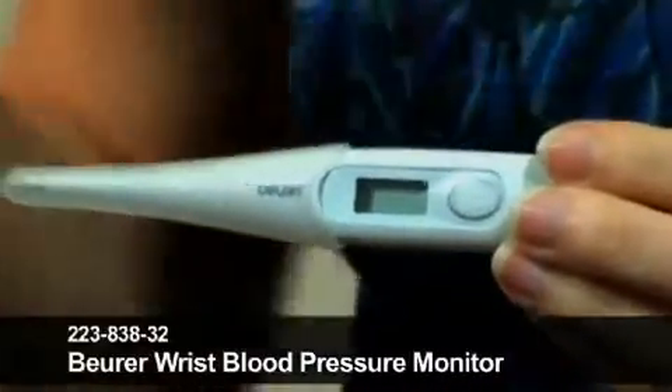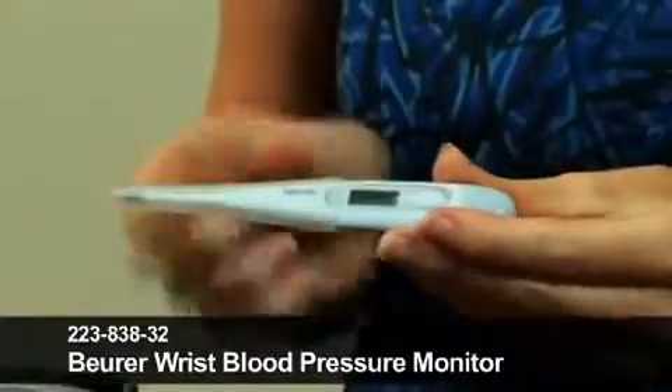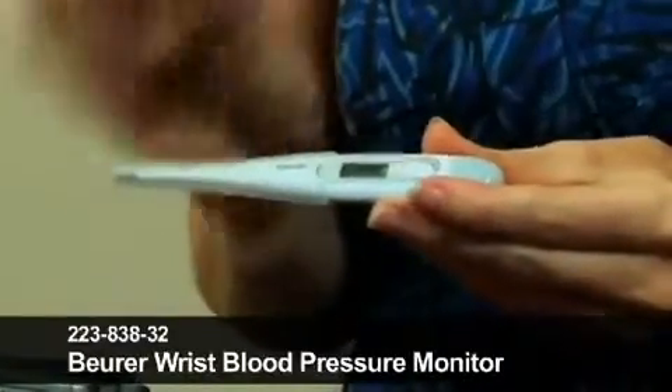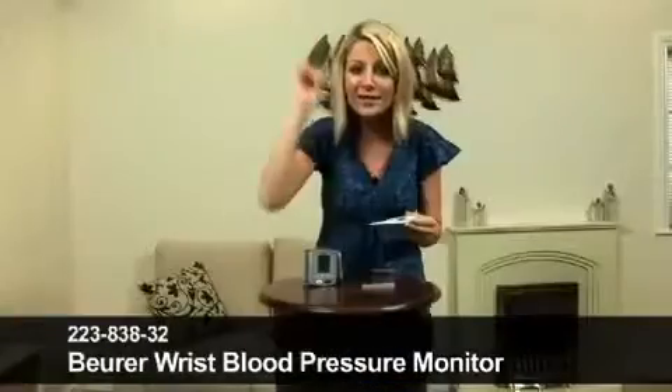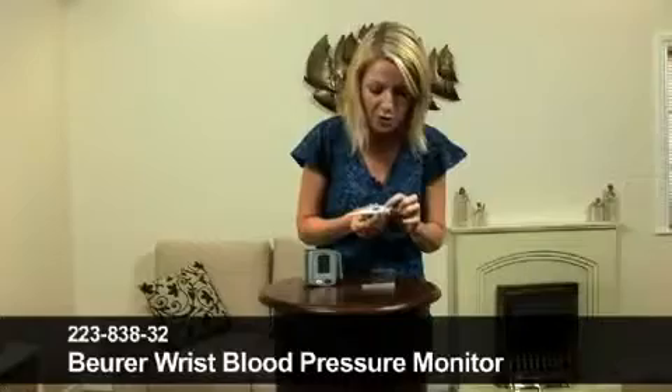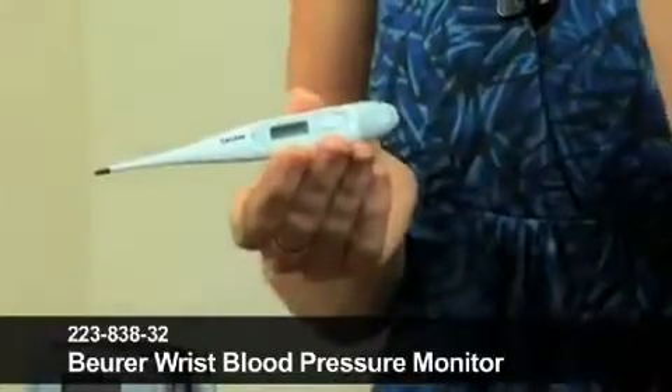Really, really useful to have if you've got children in the house, or just for yourself to check your temperature. It comes with a plastic cover here to keep it nice and clean. We'll pop that off, and we'll take my temperature as well and see how hot it is under these lights. You switch it on just by pressing this button here — it's really, really simple to use — and then pop it into the mouth.